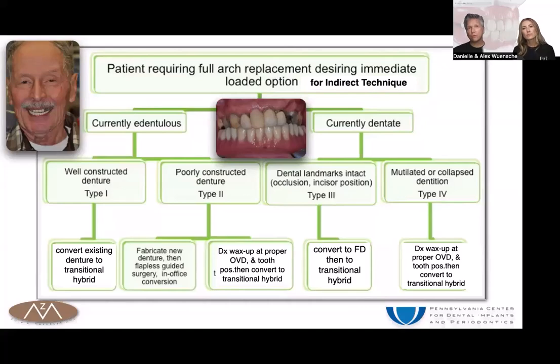So now if we're starting towards planning a case, there's a little decision tree we made here. I want to say thank you to Dr. Fava, Dr. Levine, and also Dr. Markrauer. They put that decision tree together actually, and I showed that in a lecture with them.